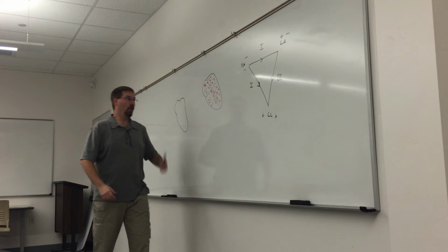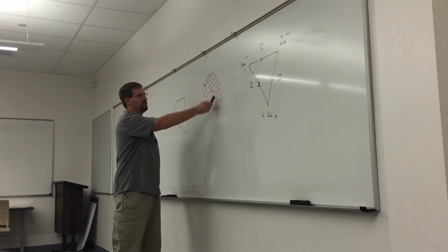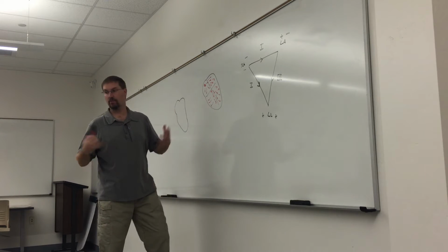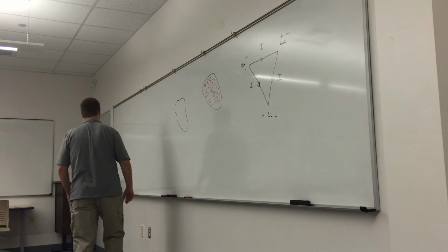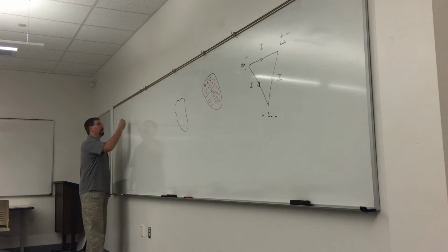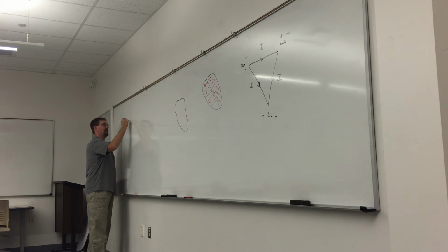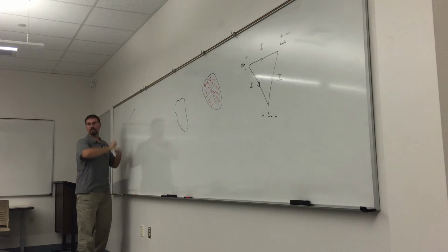Okay, so what we do to find the axis is we add up all these vectors here, and we get what the average vector is. And the way that adding vectors up, you can think of adding a vector kind of like this. So imagine, if you will, that I have my point of origin here, and from that point I have a vector, and the length of the vector is the magnitude.